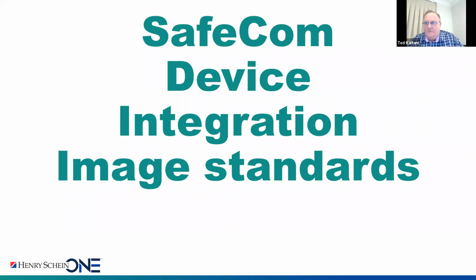Same thing with third-party software. If they're going to run different devices, they don't need Health Canada approval to run the devices because it is assumed that you do not change or manipulate the image that is coming from the device. That's what is assumed in that scenario. If you are changing, and by change I mean if you're filtering an image from a non-approved medical device, that is not the correct thing to do. I don't know if you can call it illegal, but it should be almost illegal to do that.